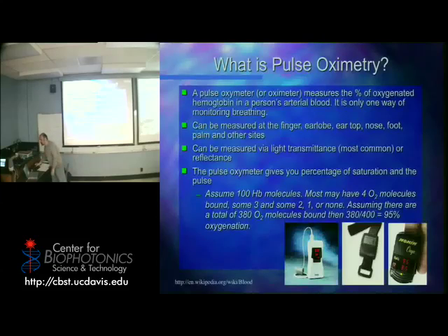So in the hospital, these devices look more like a box. And if you guys are curious, I have pictures later on, because recently I had to make some visits to the hospital, not for myself, but for others, and I took pictures of all these things. But they are bigger machines, and they come off with a wire and a little Band-Aid looking thing.